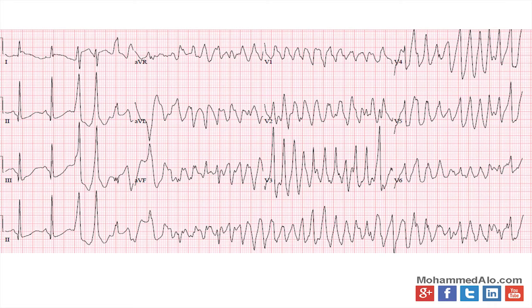Next here, you've got a pattern. Somebody had some pretty sinus beats, then had a couple of early PVCs or early PAC fusion beats, and then decompensated into this rhythm, which is called polymorphic VTAC. All that means is different shaped VTAC, which we call torsades de pointes, this twisting around a point. This is torsades. How do you get them out of this? You have to defibrillate them, and you give them amiodarone to stabilize ventricular arrhythmias. Amiodarone and magnesium in this case would help. The key is figuring out what happened with this.